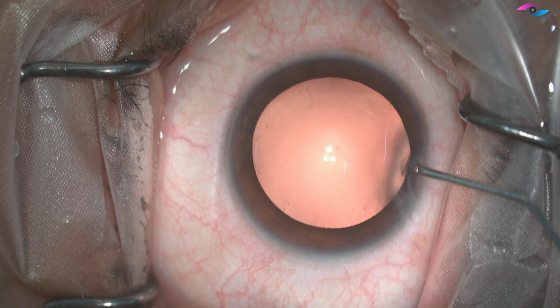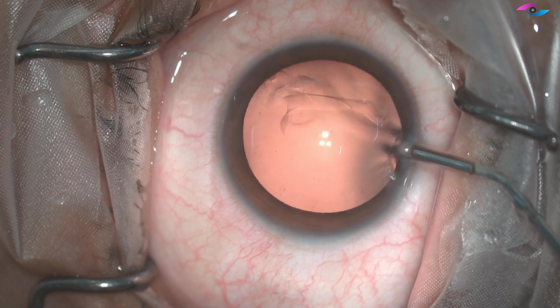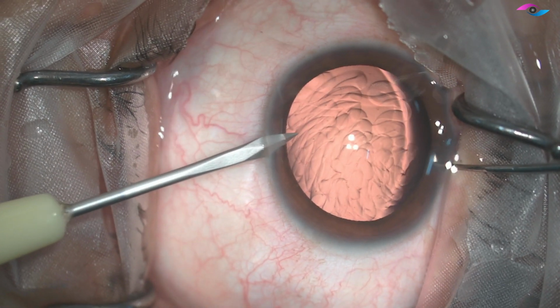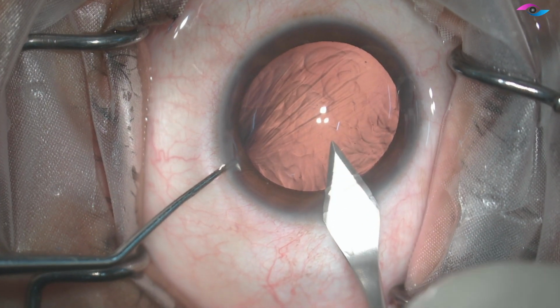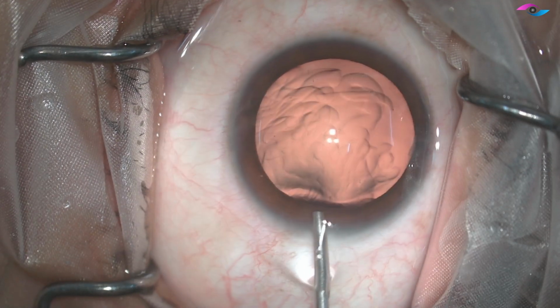Now we come to the patient, and through a side port we are injecting again a dispersive viscoelastic. Avoid overfilling the chamber, just enough so that you can see the chains of the viscoelastic, and then we are creating the main incision here. To comfortably implant the ICL inside the eye, we need about 3 or 3.2 millimeters of incision.